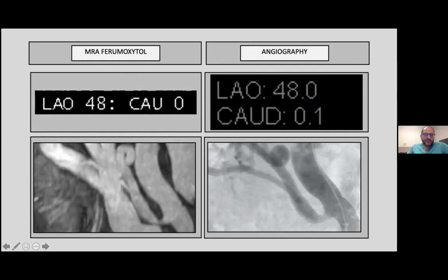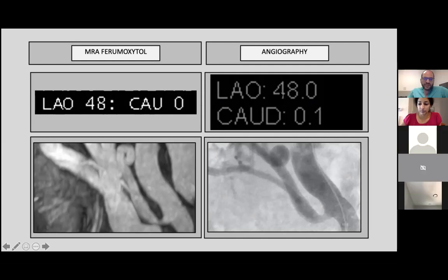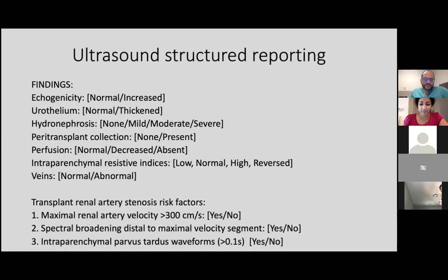So we provide in our MRI reports the table positioning if there's a positive stenosis, so that the interventional radiologist can go right to that table positioning and get the same kind of imaging. Our interventional radiologists really like having this information, and even in cases where they know that there's a stenosis and they want to fix it, they still want to get the MRI so that they can have that information. Yeah, it's very cool.